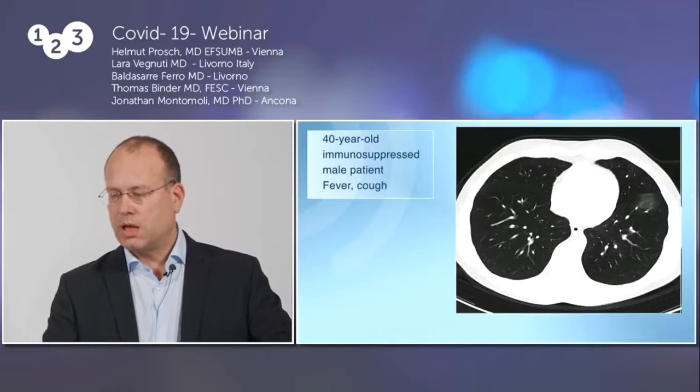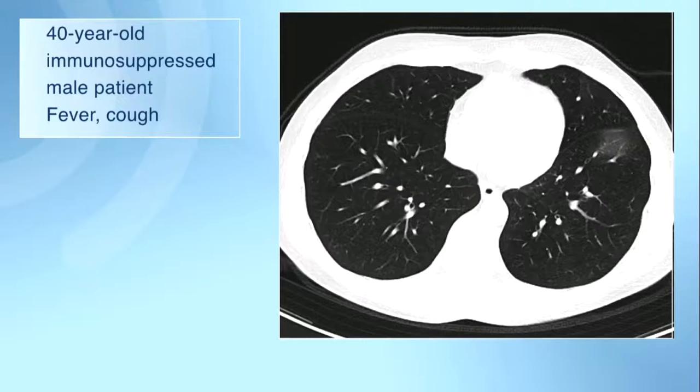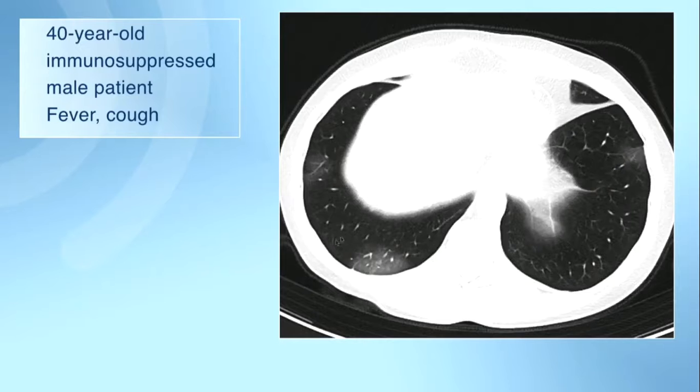That's another patient, just two patients, just to briefly show you what to look for. A patient who is immunosuppressed, and he came in despite his doctors told him to stay at home. And he got scanned then already with a suspicion of a COVID disease, and you see here again, and now you know how it looks like, that's ground glass. But in contrast to what I showed you before, it's not that much in the periphery, it's more rounded, and also here, more rounded ground glass, not as band-like as in the case before. And that's another pretty characteristic manifestation of this disease.